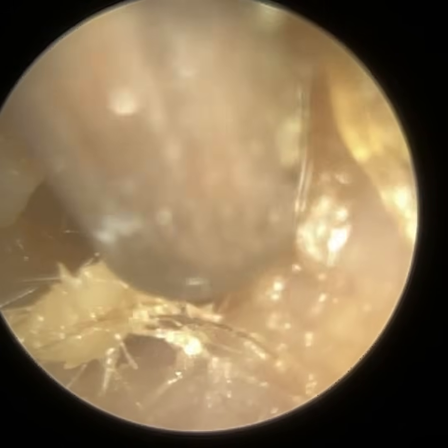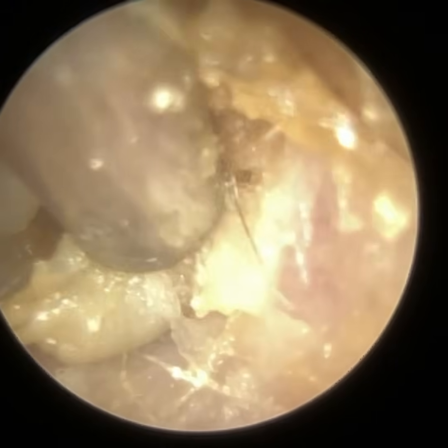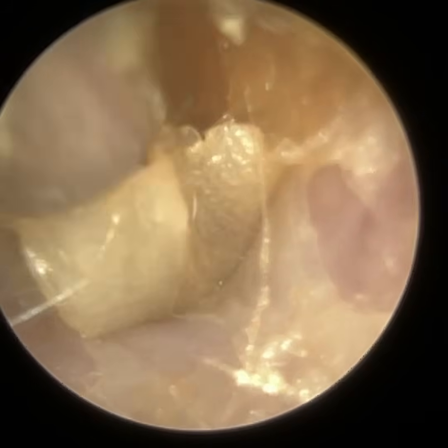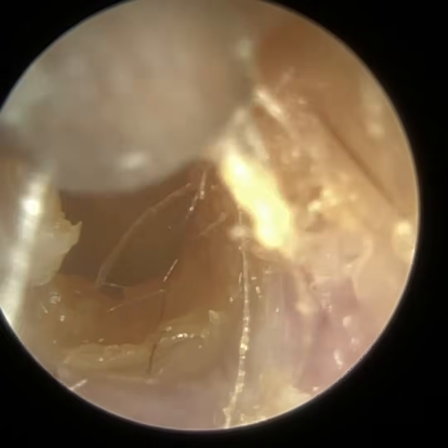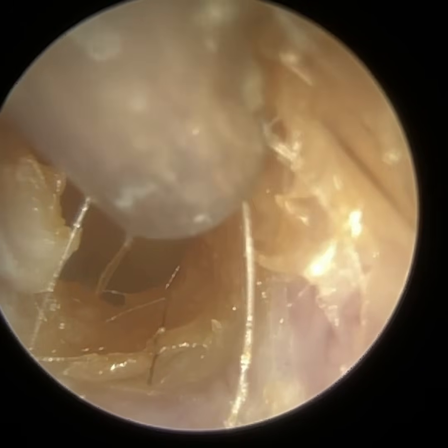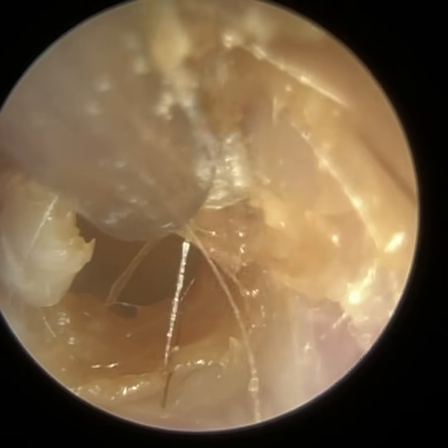With regards to the inner 2/3 of the ear canal, the osseous portion, the bony portion, you only have this epidermis layer of skin lining the ear canal, and directly underneath you have the bone. And so the skin that lines the inner 2/3 of the ear canal is probably less than 0.1 millimeters in thickness. However, on the outer third of the ear canal, the cartilaginous portion, the skin has three layers.